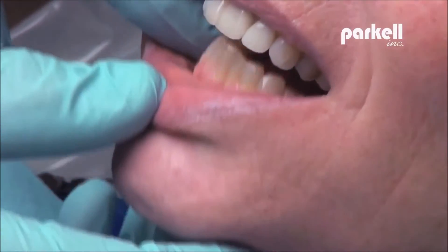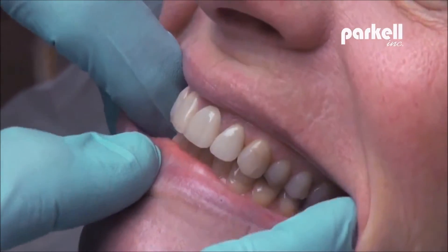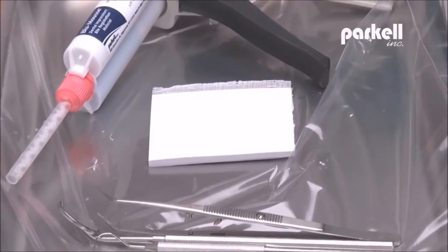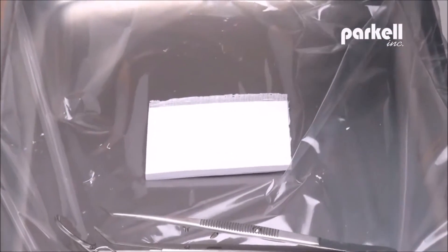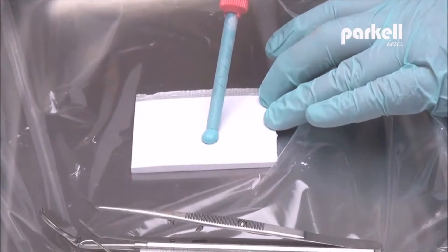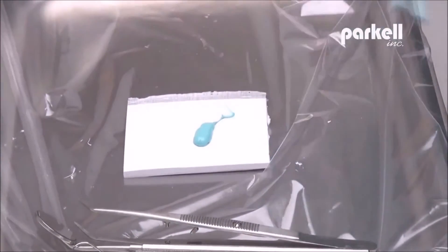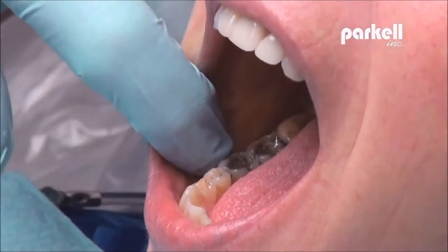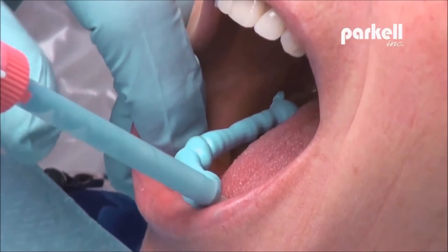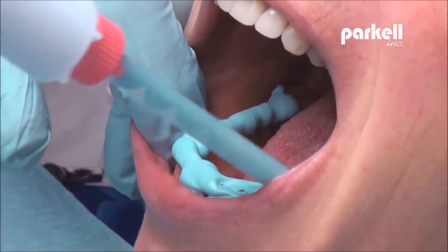Program patient's bite before extrusion and visualize interocclusal landmarks. Squeeze trigger with moderate pressure to bleed a 5 mm, one-quarter inch of material a second time before dispensing the material directly into patient's mouth to ensure even flow. Proceed immediately with registration by extruding Blue Moose over biting surfaces of teeth.